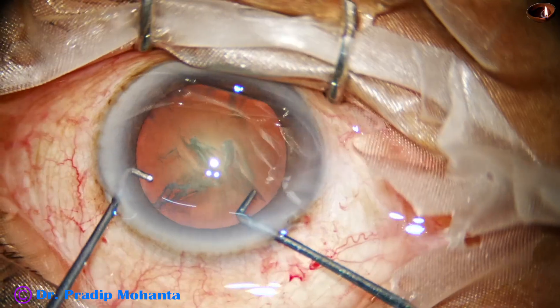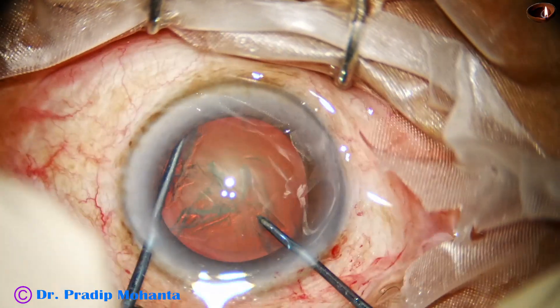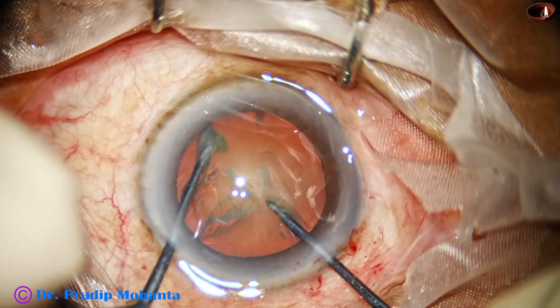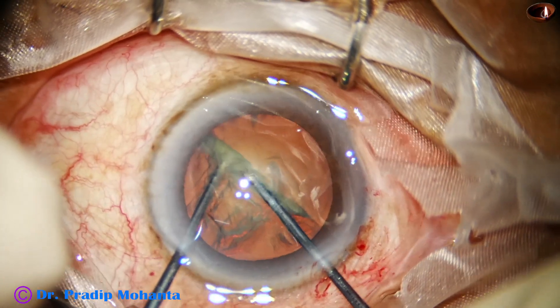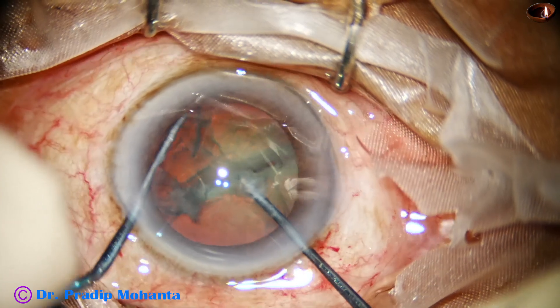See the magic of this pre-chopper. It engages here — the nucleus sustainer hooks the opposite equator. The two instruments come to each other, and see the beautiful two hemi nuclei.